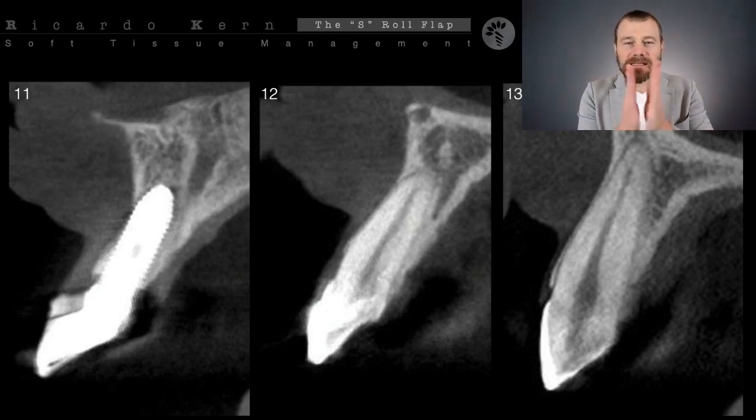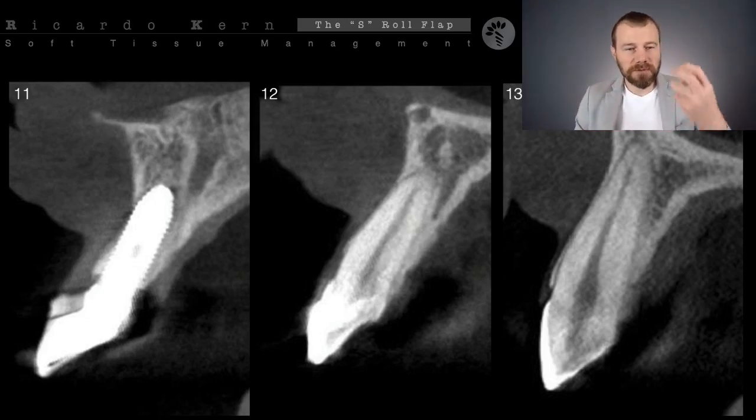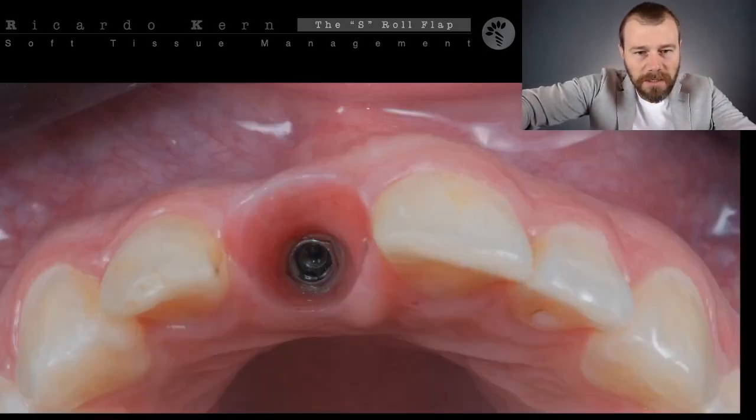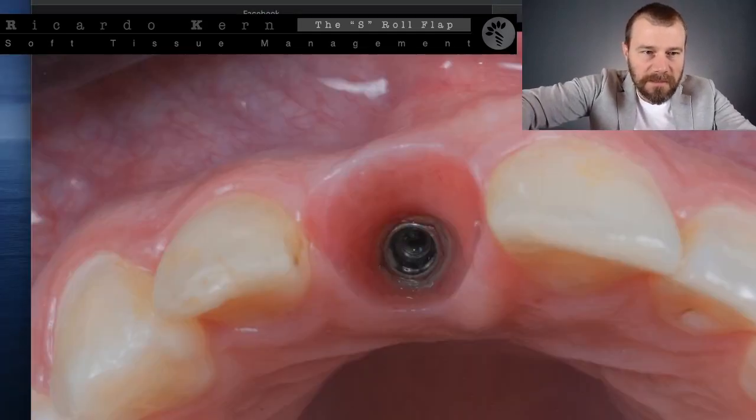So at least where the tissue is thin, you're going to full thickness. And you see the difference in my implant area. Usually in the implant area, you're going to have a little more tissue available for you to decide to do a split thickness flap, okay? And I'm going to return once more to the drawing board to explain that.